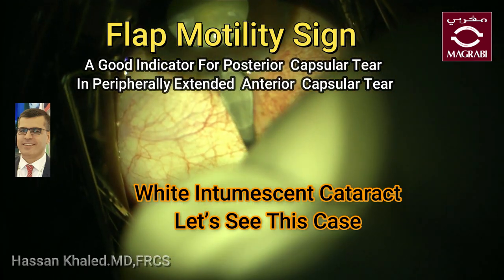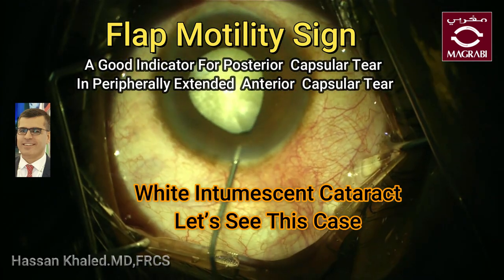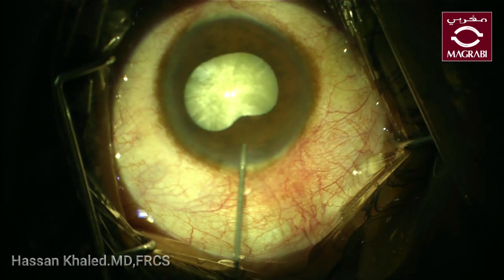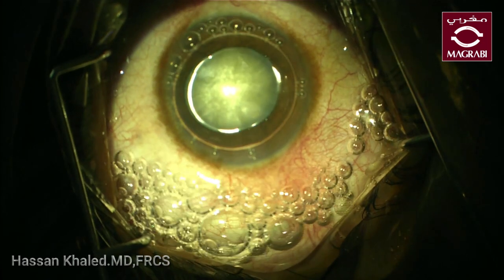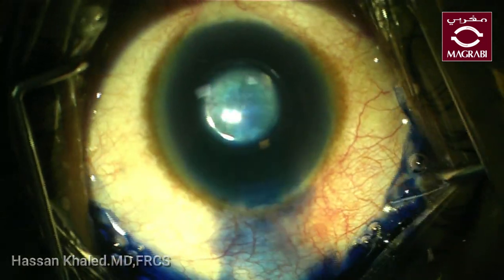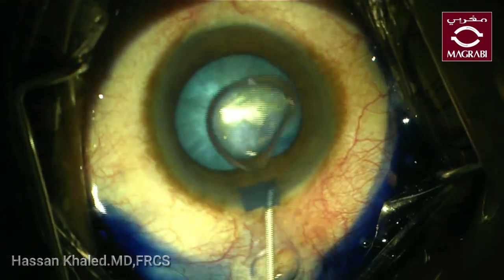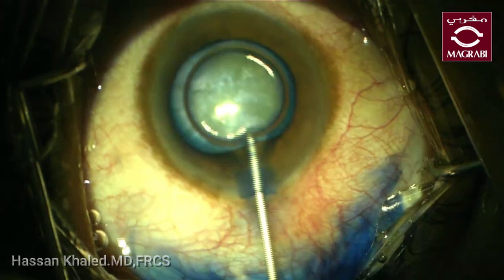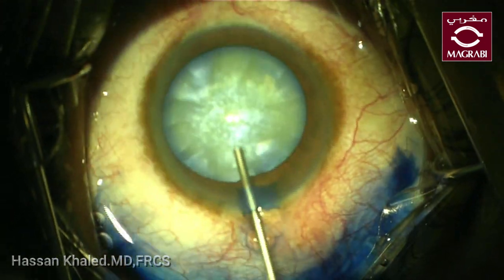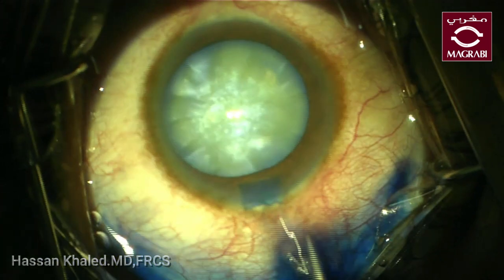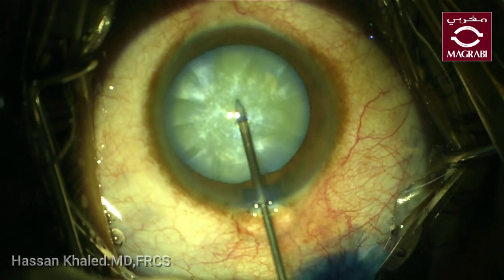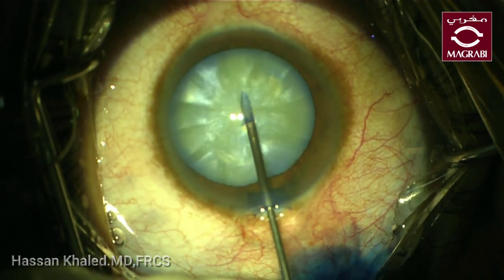Here I'm going to talk about the flap motility sign. This is a case of white intumescent cataract in a 40-year-old male patient. The most challenging aspect in this case is the high incidence of peripheral extension during anterior capsulorrhexis, with or without post-equatorial extension and posterior capsular tear.